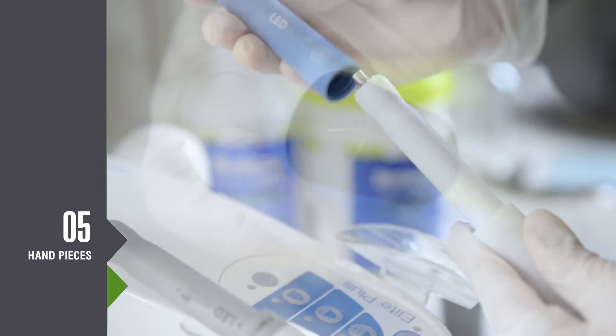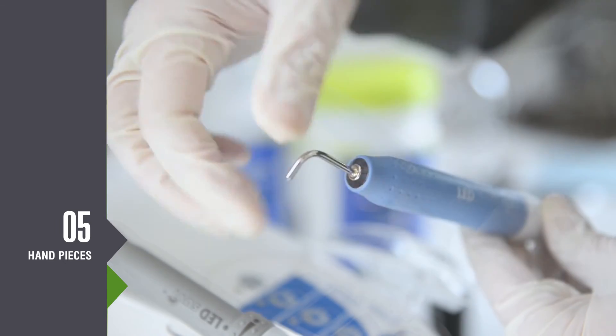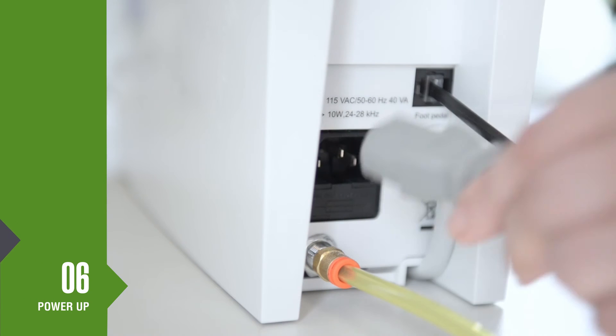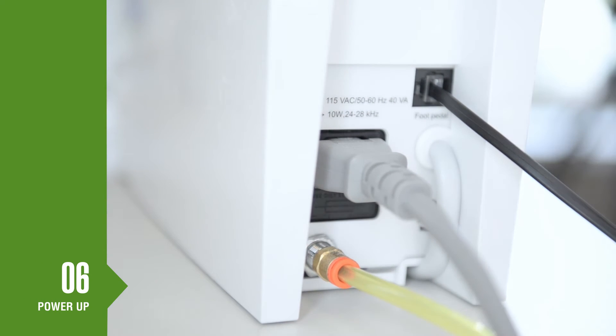Slide a sterilized grip onto the polisher handpiece and gently screw on the polisher nozzle. To complete setup, plug one end of the power cord into the back of the unit and the other to the GFCI power outlet.